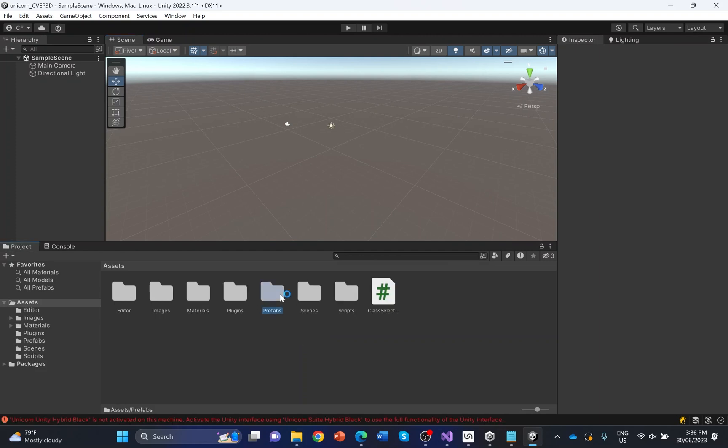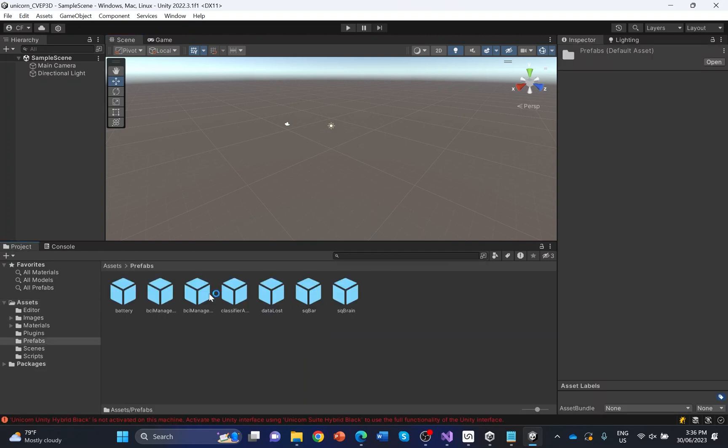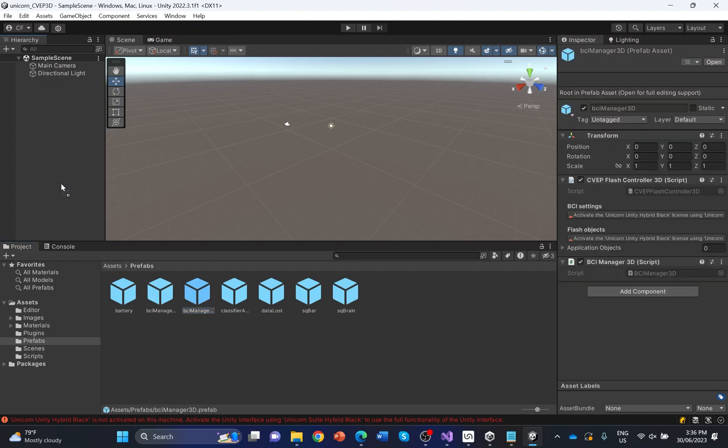Open the Prefabs folder. You should find a BCI Manager prefab for 2D and for 3D projects there. Select the BCI Manager for 3D projects and drag it into your scene.